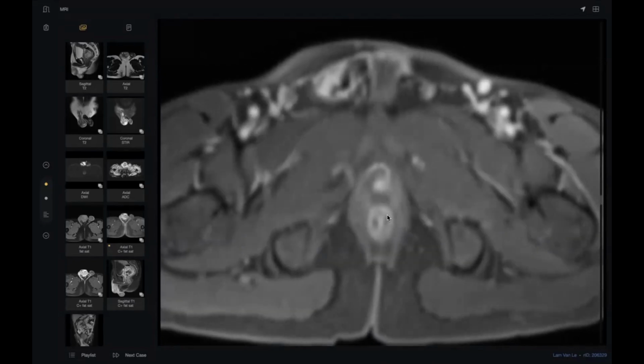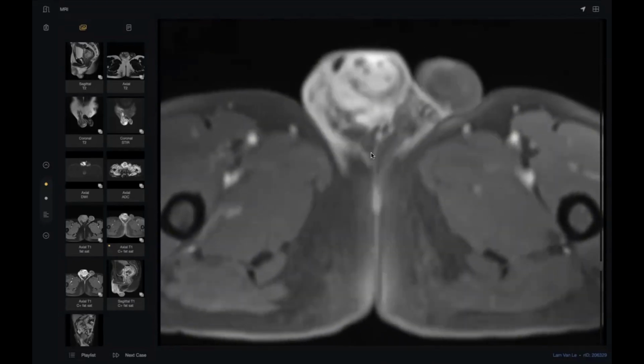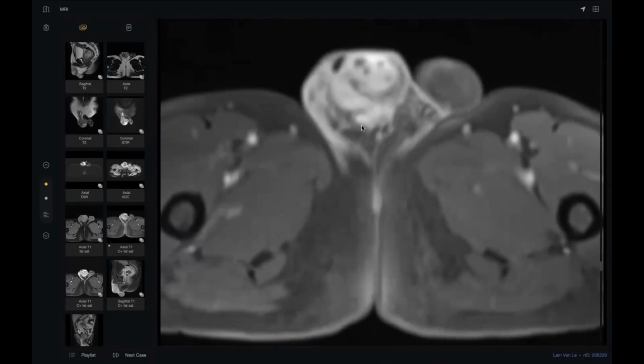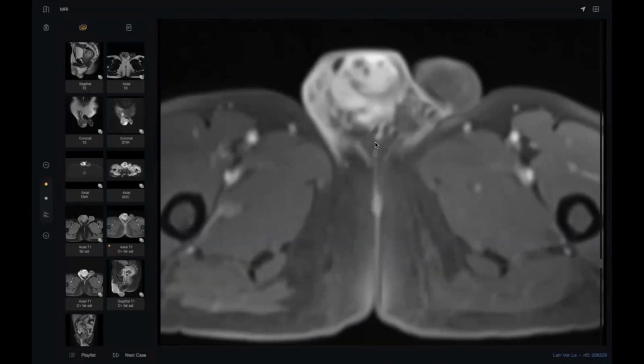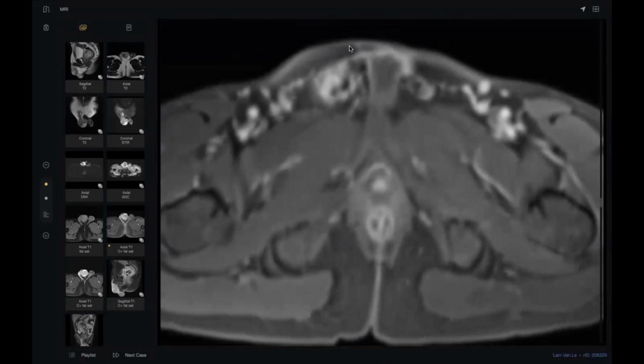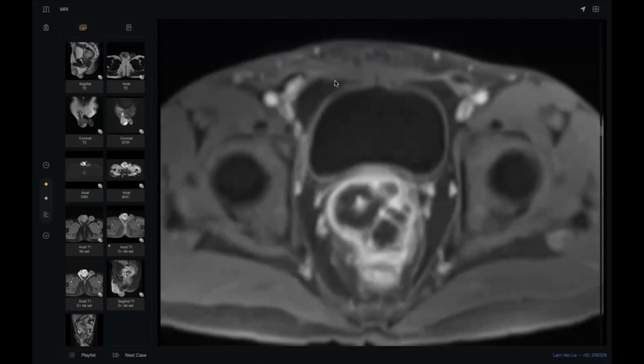Why is this not tumor? Because if I suppose this is tumor, at least this is an aggressive process. Then it must enlarge and infiltrate everything here and here. It will not just affect the scrotal wall and then stop and then go along the cord, only along the cord, and then from the cord to the seminal vesicle.